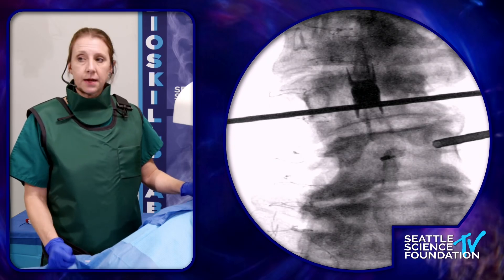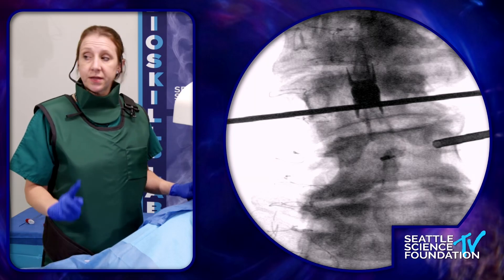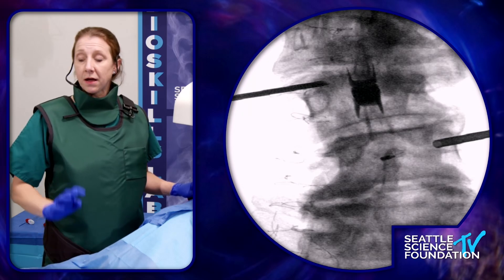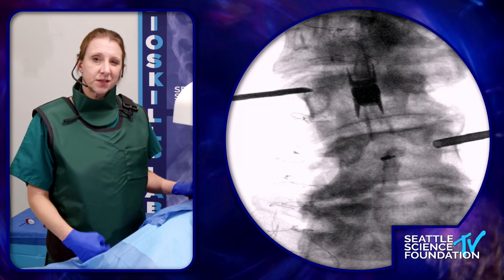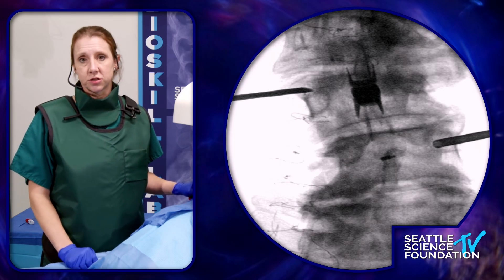When I'm doing the lesion on the right side, as I have just placed, while that burn is occurring, I would begin to place my assembly on the left pedicle so that it's out of the way and I can move ahead in the procedure and be efficient.